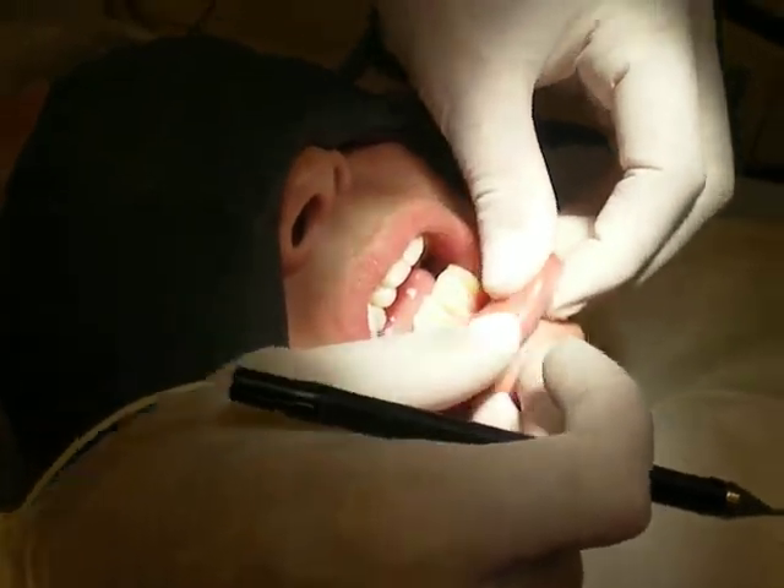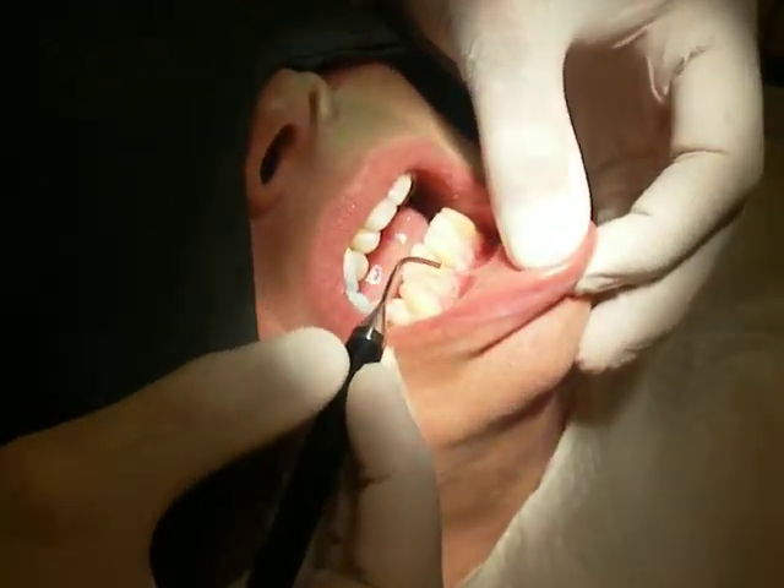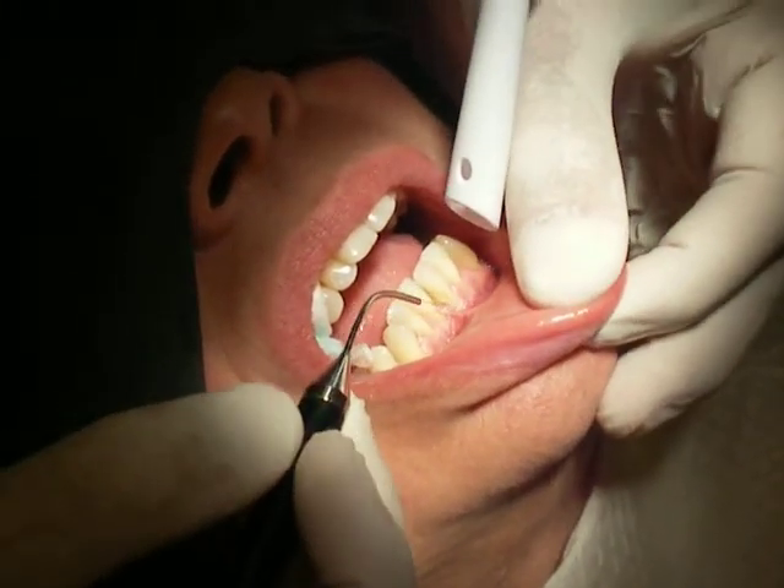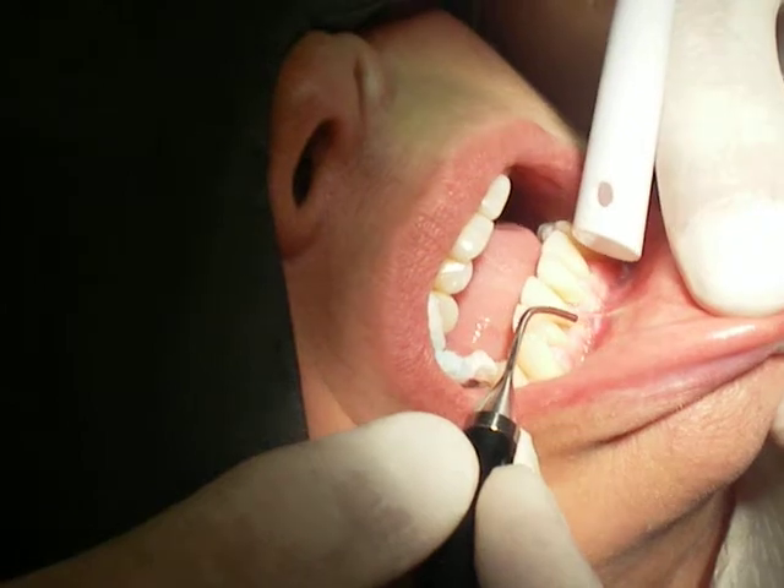The LENAP laser is being used to perform a lower frenectomy. It's set on the diode mode. We're going to eliminate the muscle pull in this area.